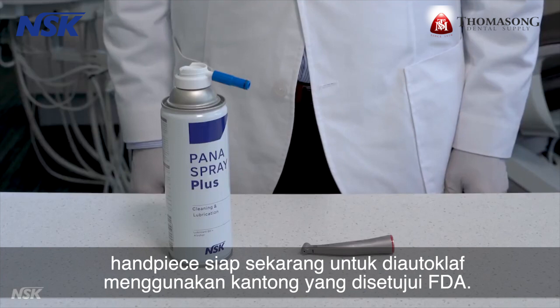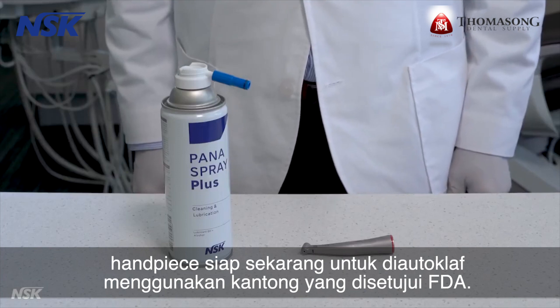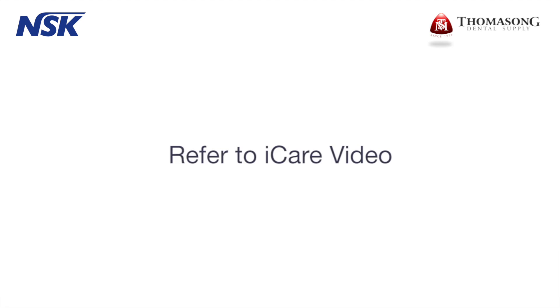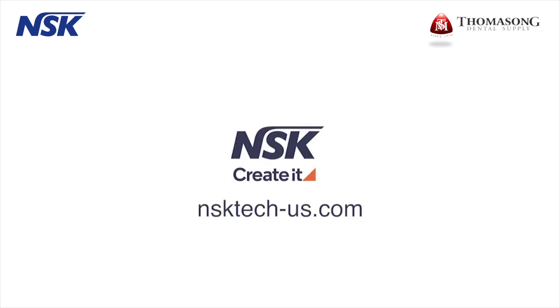The attachment is now ready to be autoclaved using the FDA approved pouch. For the automatic lubrication process, refer to the iCare video. If you have any further questions, please visit our support site at nsktech-us.com.